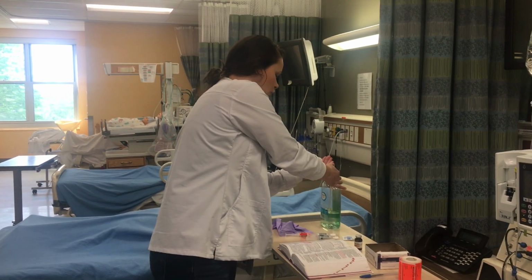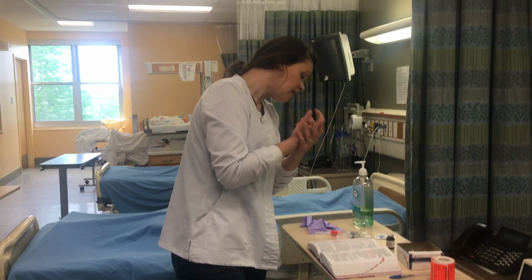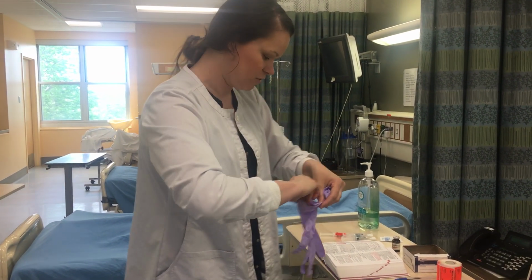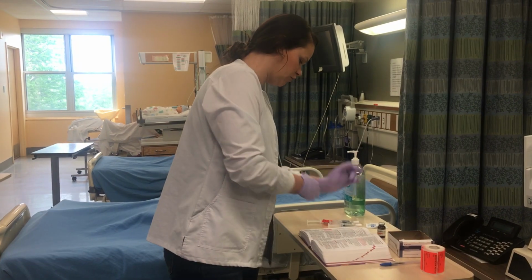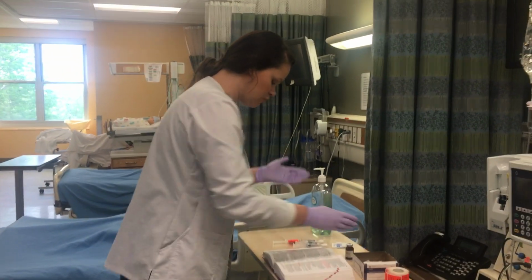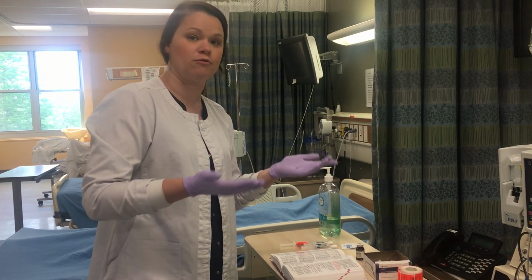So I'm going to prepare, I'm going to use my hand sanitizer or soap and water. And for the administration of this medication, we would don gloves. So I'm going to put those on. I have already drawn up my medication. Here we have our furosemide, and we are going to give 20 milligrams. And if you remember right from the text here, it tells us that we're going to give 20 milligrams in a minute.